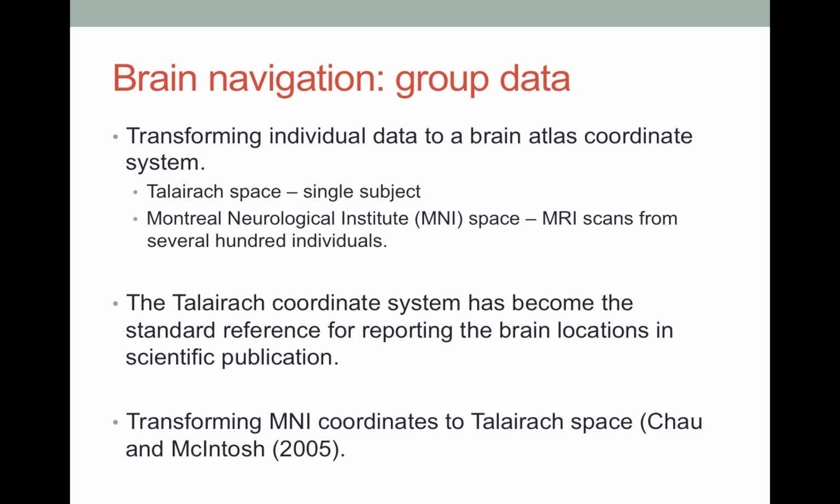To allow better representation of average neuroanatomy, the MNI created an average brain template based on the MRI scans from several hundred individuals.